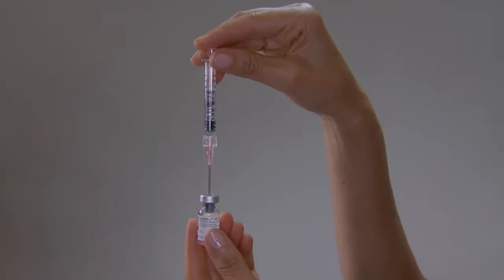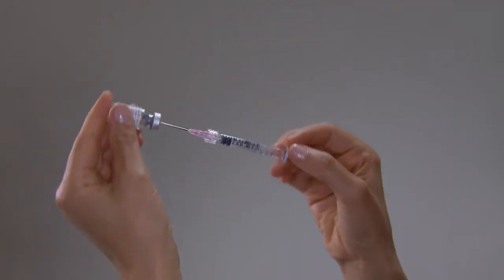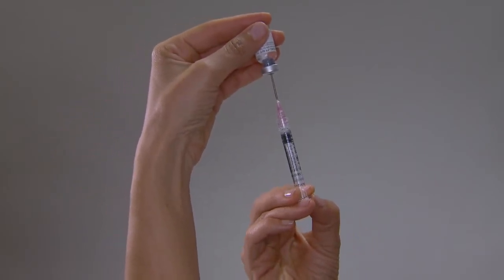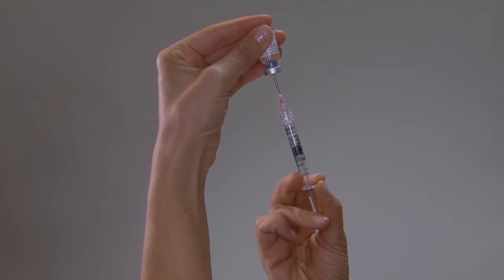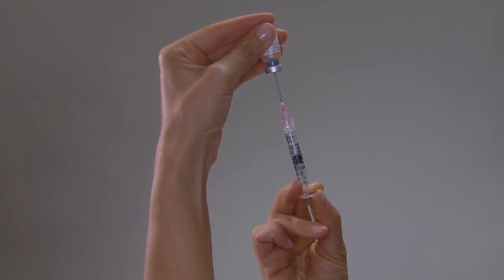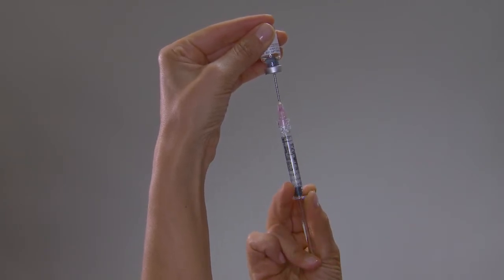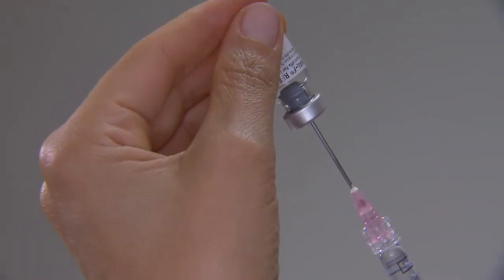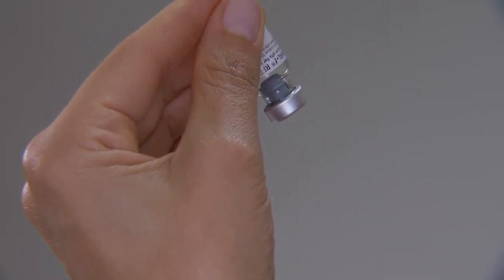Step 2. Draw up. Without removing the 18 gauge 1.5 inch pink needle, invert the vial and slowly pull back the needle as far as needed and withdraw the entire contents of the vial into the syringe. Make sure the tip of the needle remains in the solution by slowly backing the needle out of the vial to withdraw as much of the solution as possible. Remove the 18 gauge 1.5 inch needle and syringe containing the solution from the vial.